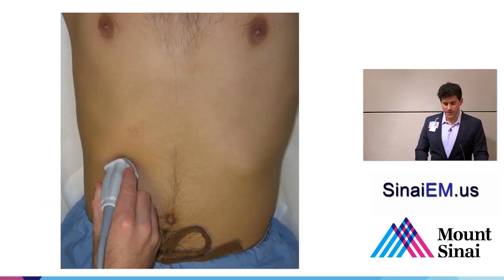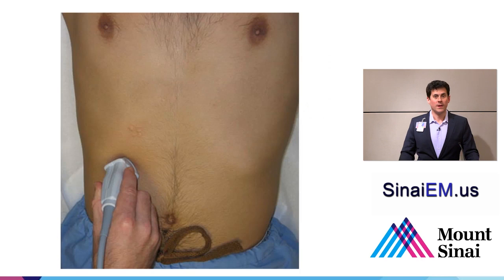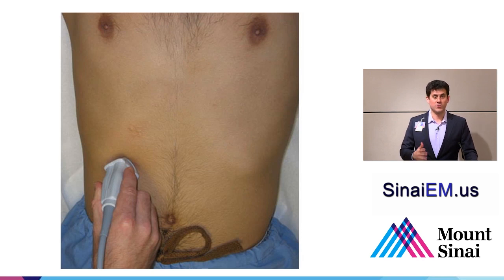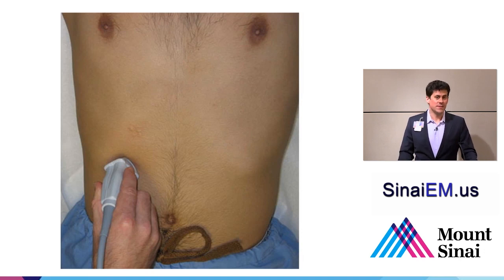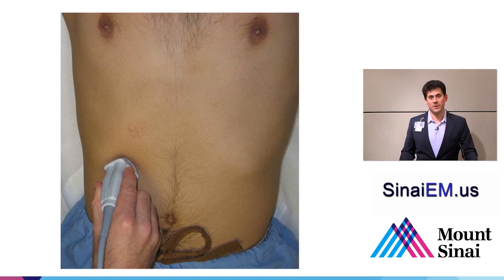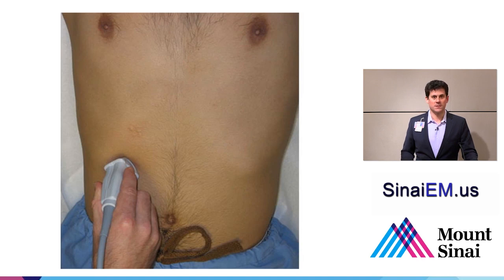Typically we're going to hold the probe at the costal margin around the mid-clavicular line. Most people describe doing a costal sweep, with the probe in a longitudinal or sagittal orientation, sweeping from left to right along the costal margin. In my experience, the gallbladder is often obscured below the costal margin by bowel gas, and in heavier patients it can be difficult to get through skin and soft tissues. So while the costal sweep approach is helpful, understanding where the gallbladder sits makes it a little easier to find using a slightly different approach.